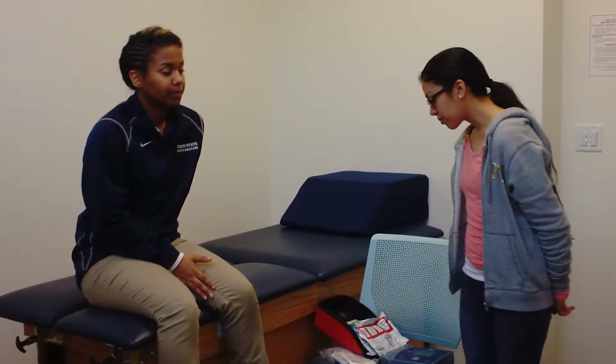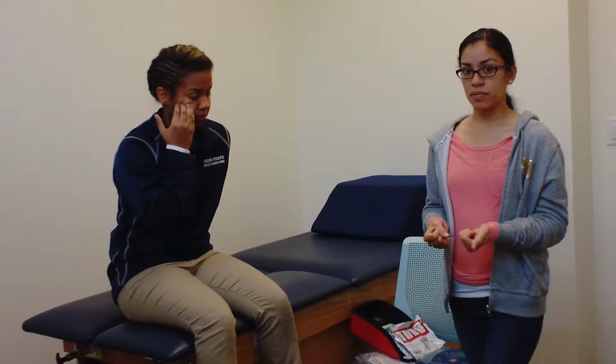An AED is an automated external defibrillator machine that is portable and can be taken anywhere with you, even in a car. An AED works for someone who has or is experiencing a sudden cardiac arrest. An AED helps by restoring an organized heartbeat for the patient. For instance, if the patient is having ventricular fibrillation, which are disorganized heartbeats, the AED will help restore those heartbeats in an organized manner.